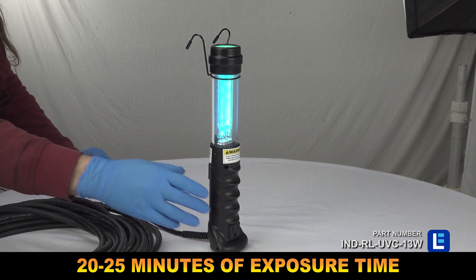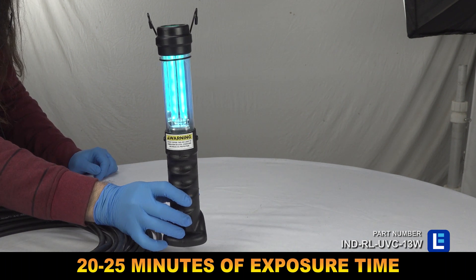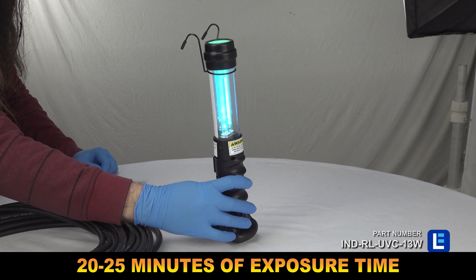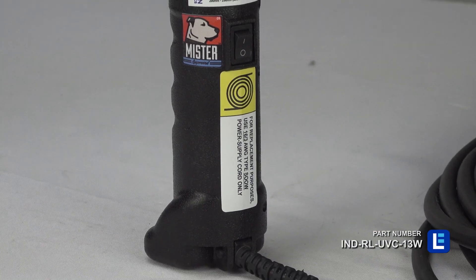The portable UVC light features an accessible toggle switch. This light is a powerful sanitation solution for industrial sites and commercial facilities.